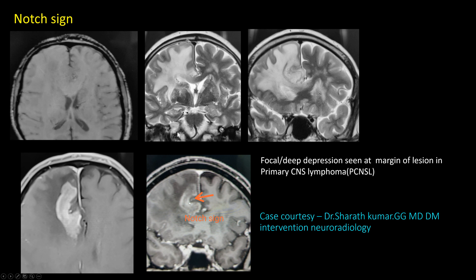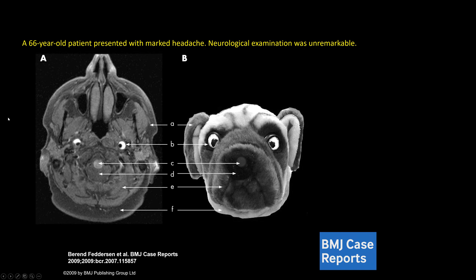Next: a 66-year-old patient presented with marked headache; neurological examination was unremarkable. Along the internal carotid arteries, you can see peripheral hyperintense areas in bilateral internal carotid arteries, which are mural hematomas, with a residual lumen visible. This is classical for bilateral internal carotid artery dissection.